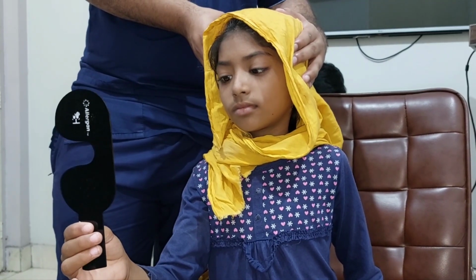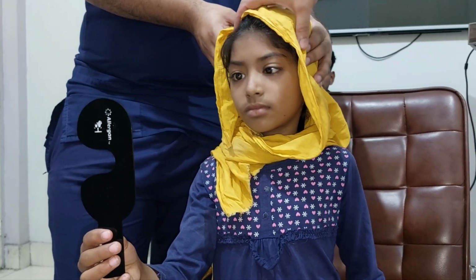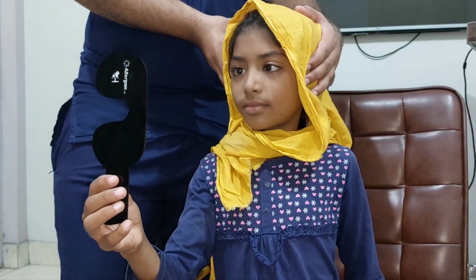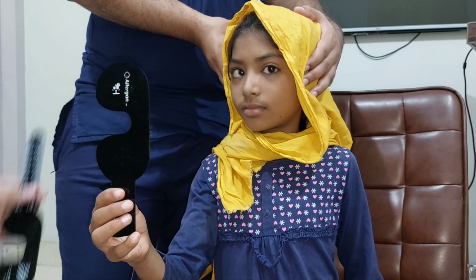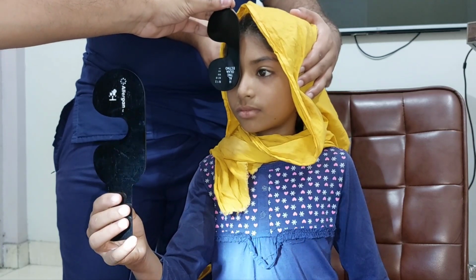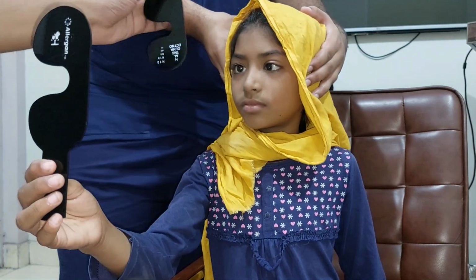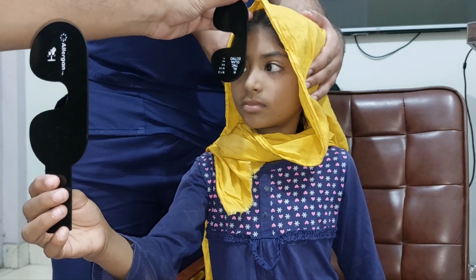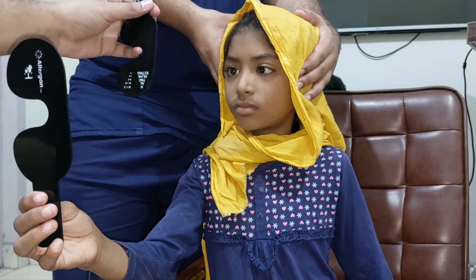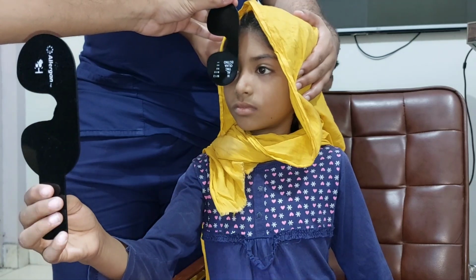See, first we want to see whether the left eye takes up the foveal fixation or not. So, do you think that the eye is not becoming straight? No. You keep the cover on in front of the right eye for a few seconds and let the left eye take up the fixation. So you have to cover the straight eye for a few seconds so that the deviating eye is dissociated and takes up the fixation. The patient is relatively uncooperative. I think that is the reason the results are ambiguous. So keep looking here, okay?